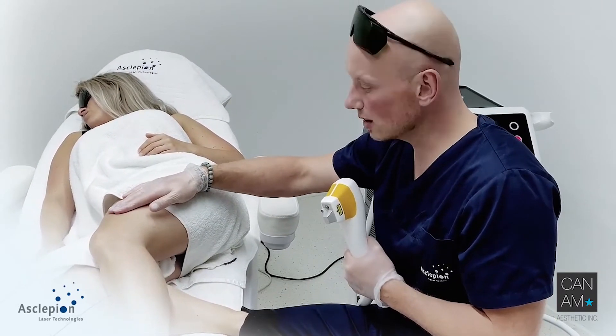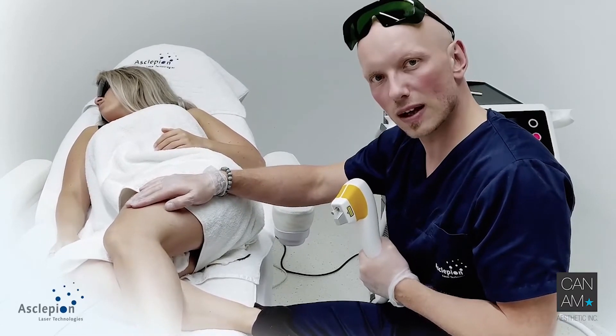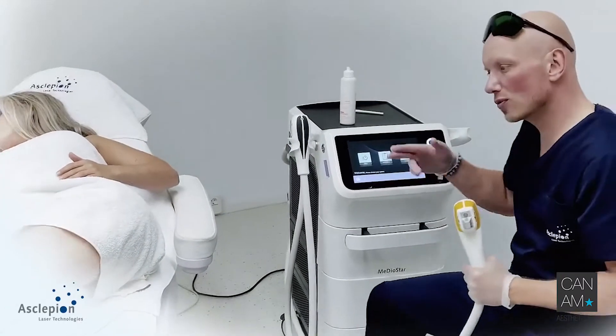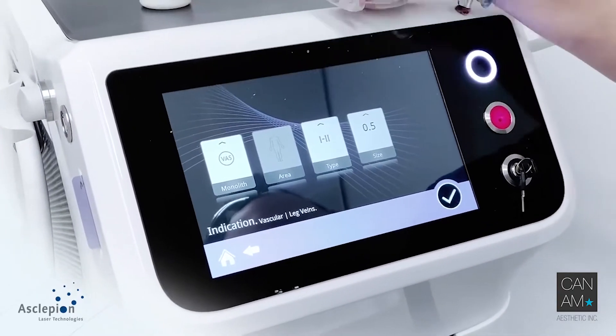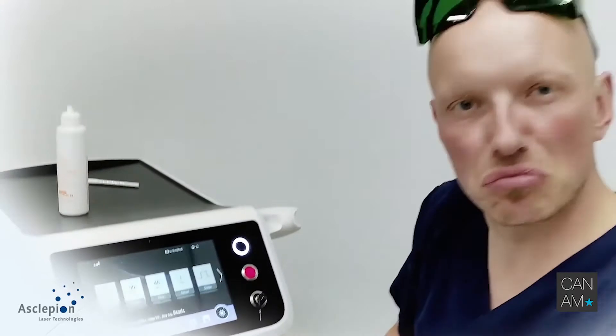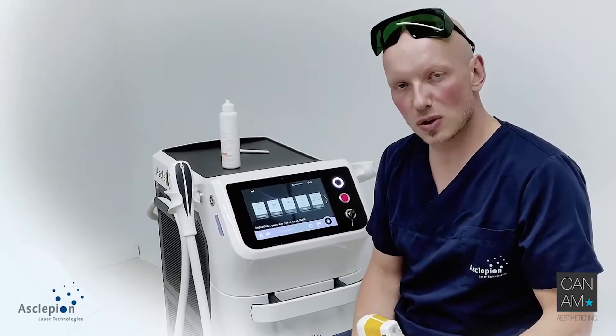What are we doing here? We are checking once more the skin type, the size — the diameter of the vessel — and the device will come up with a recommendation. We go for indication: vascular, leg veins, proper skin type. Let's say small and thin. This is a proper way to start. Those recommendations are always on the safe side. You might increase when, if you see a collapse of the vessel immediately after application of the laser, then you are on the safe side.